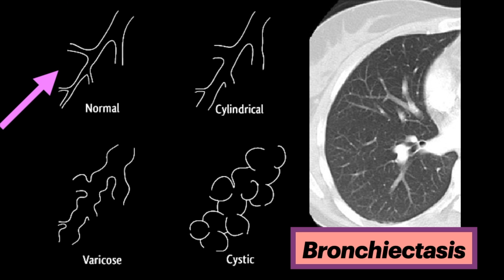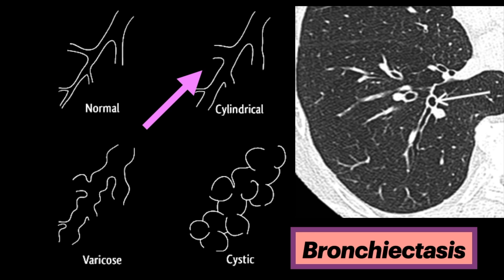Bronchiectasis may be classified as cylindrical, varicose, or cystic, depending on the appearance of the affected bronchi. This arrow points to a normal airway with normal distal tapering. Cylindrical bronchiectasis is where the bronchi have a uniform caliber — they do not taper and they have parallel walls. This is called the tram track sign and signet ring sign. This is the most common form, up to about 50% of cases.